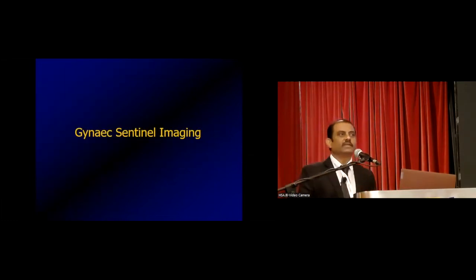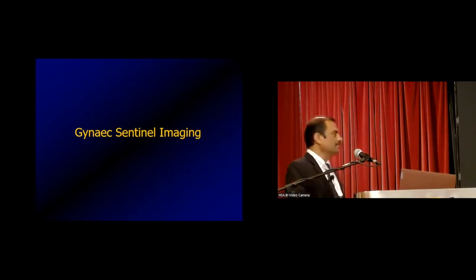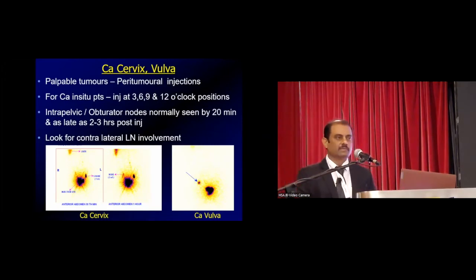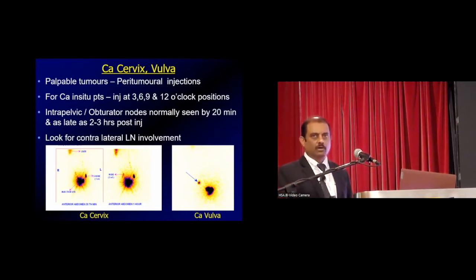Coming to the most difficult area of sentinel, gynae sentinel imaging. It is really a challenge. So there are some practical tips which I am explaining here. One is with reference to cervix and vulva. These are more superficial tumors.